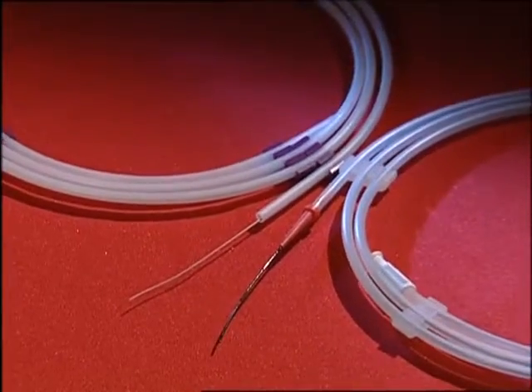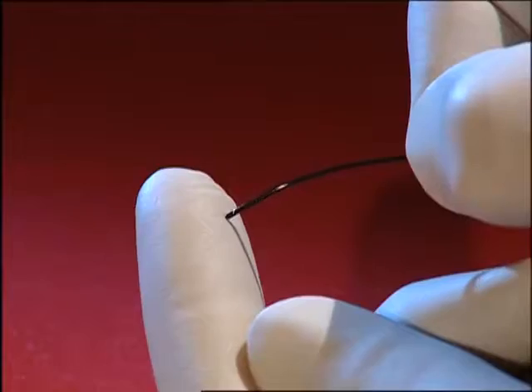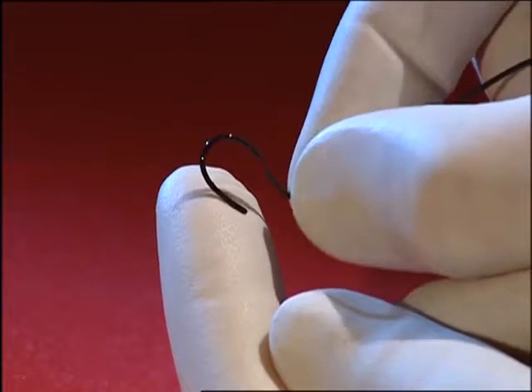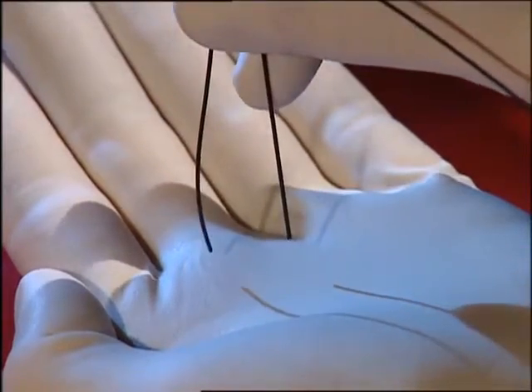It is recommended to use hydrophilic wires for flexible ureterorenoscopy in order to protect the working channel of the endoscope. These wires have very soft and floppy tips and highly flexible shafts.